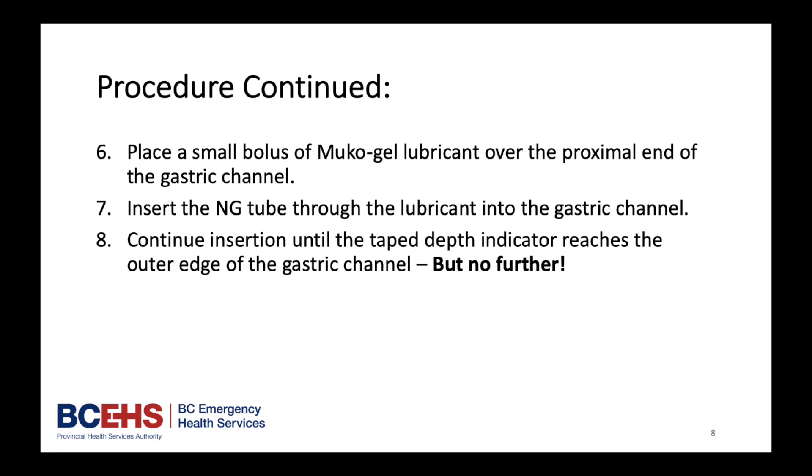Place a small bolus of mucogel lubricant over the proximal end of the gastric channel. Insert the NG tube through the lubricant into the gastric channel. Continue insertion until the taped depth indicator reaches the outer edge of the gastric channel, but no further.